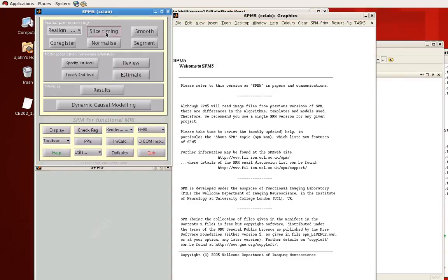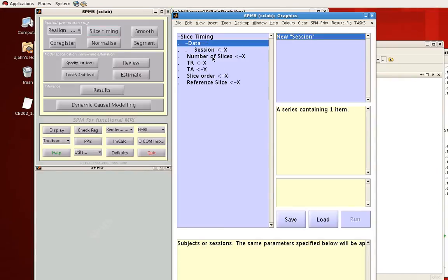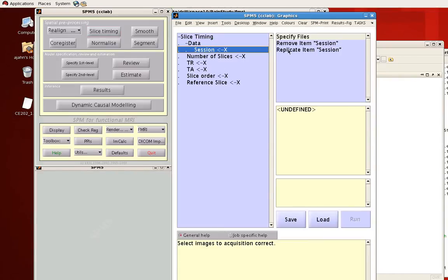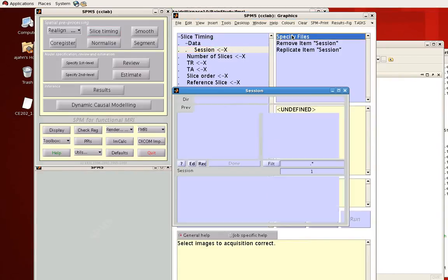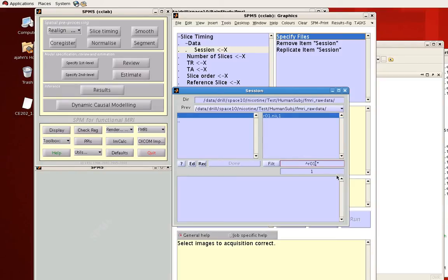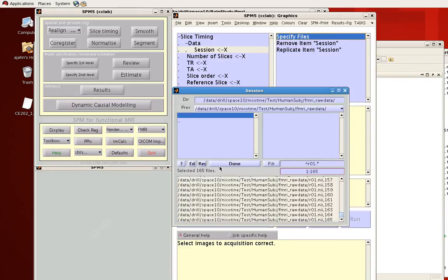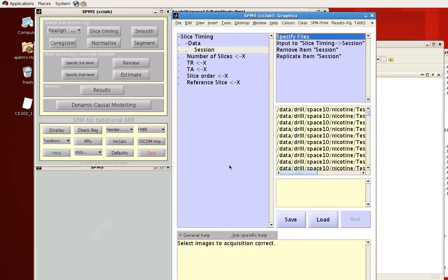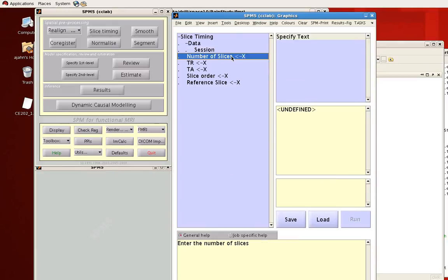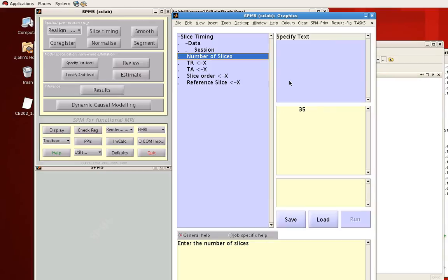So for example, if we were to do the slice timing correction step, and here we select new session and specify files here. And let's say we just want our first run that hasn't had any operations done to it yet. So I'm going to select all of those and let's just fill in this field here, so there are 35 slices.